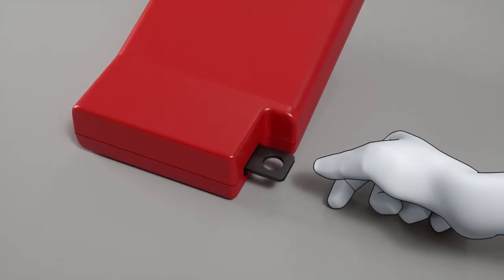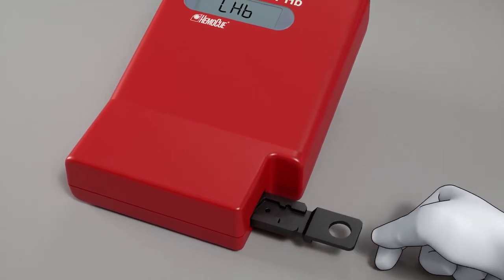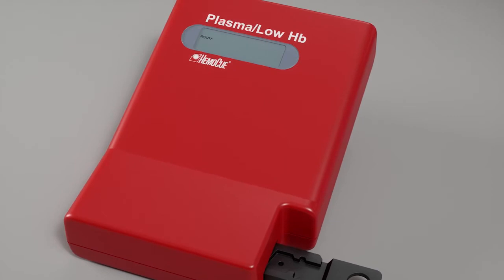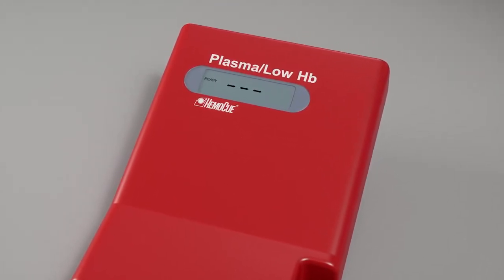Pull the cuvette holder out to its loading position to the distinct stop. After 15 seconds, the display will show ready along with three flashing dashes. The photometer is now ready for use.